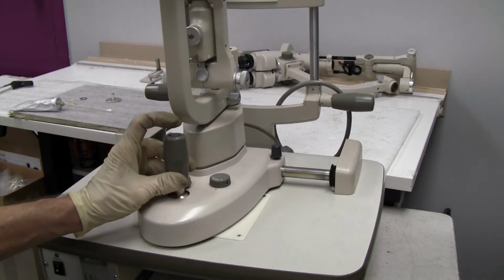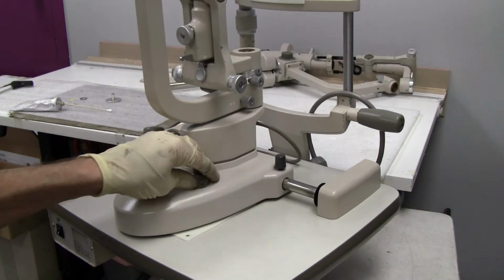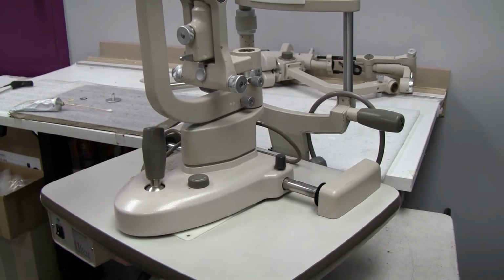The button is going to be the override switch. This is your rheostat, and this is your lock.